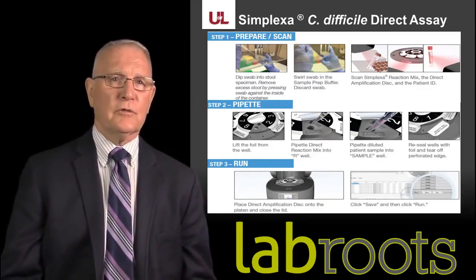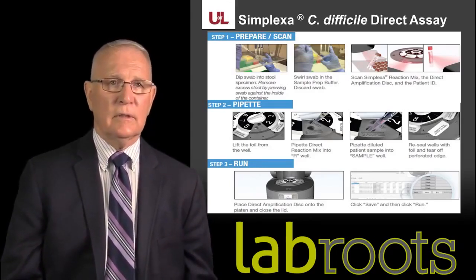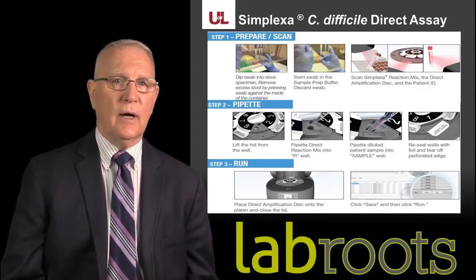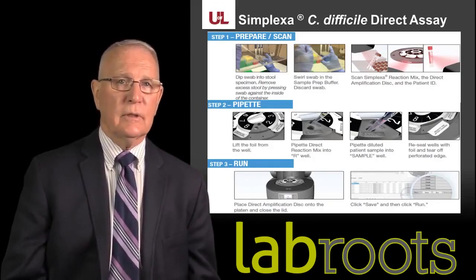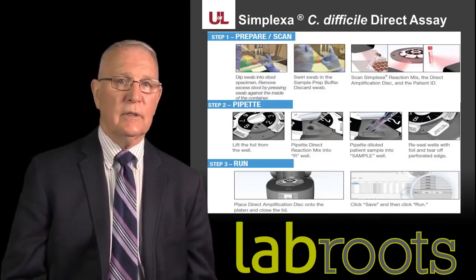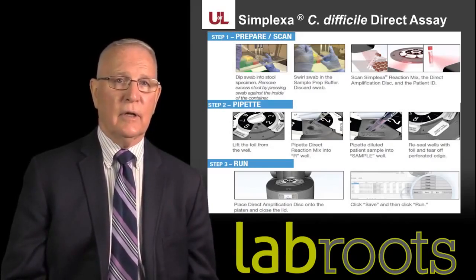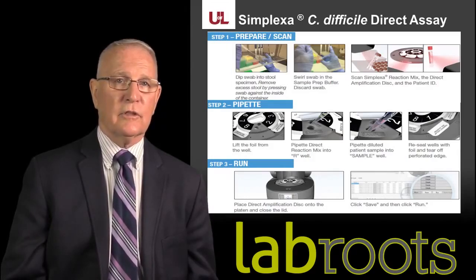And then you swirl that swab in a sample prep solution known as a buffer and discard the swab, followed by scanning the Simplexa reaction mix or master mix, and also scan the amplification disk and the patient ID. This goes into the computer-assisted database and is a very slick system.